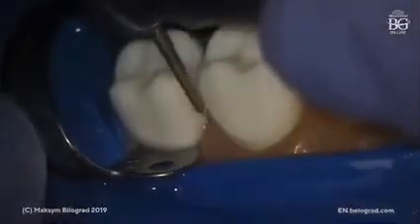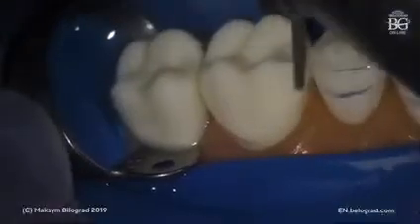Don't do this angle, otherwise you'll get an undercut. So we go, and then we turn, and we make the initial finish line on distal.